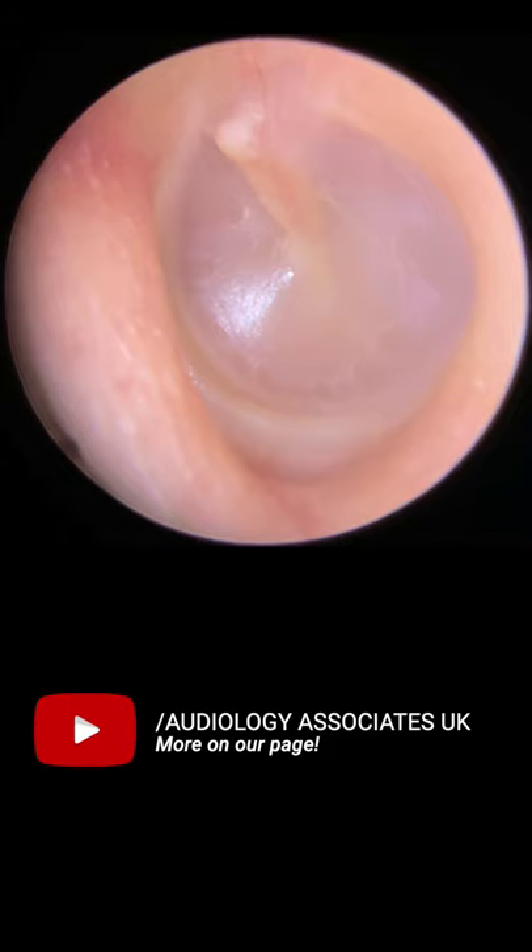Work your way in a clockwise fashion around the outside. We're looking at the skin of the eardrum. Is it nice and smooth? Is it shiny? Is it slightly translucent? It can be a little bit gray sometimes in color, but as long as it's got all those features, it's healthy skin.